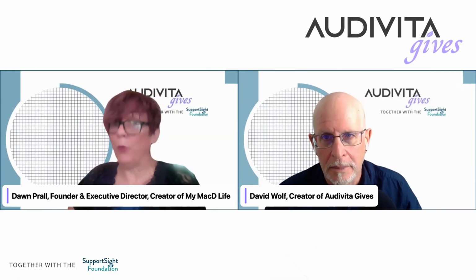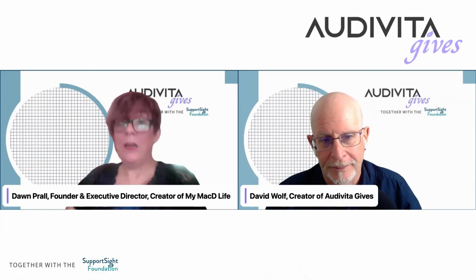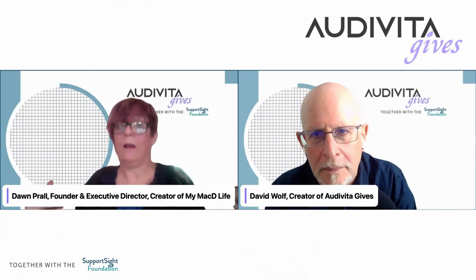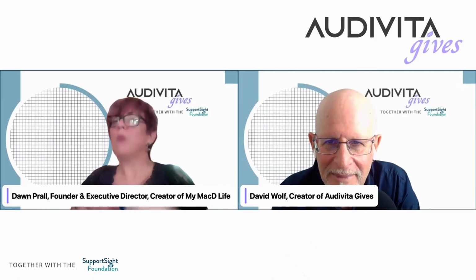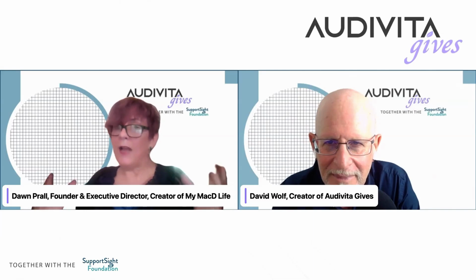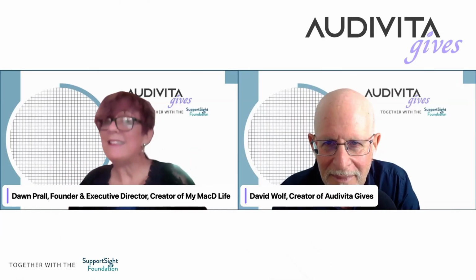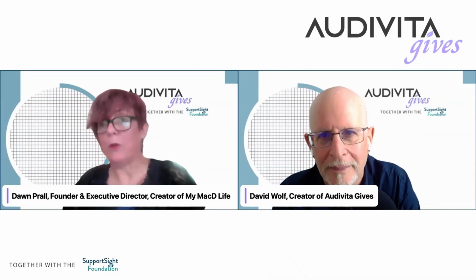If you freak out because it's really different, here's what I recommend. And I'm using that word emphatically, freak out, because sometimes in our own heads we create a lot. Oh my God, that looked different than it did yesterday. Try not to second guess yourself. Walk away from it, come back, maybe you're not awake yet, and see if your brain is seeing the same thing, but test in the exact same position. You have to keep that variable constant.